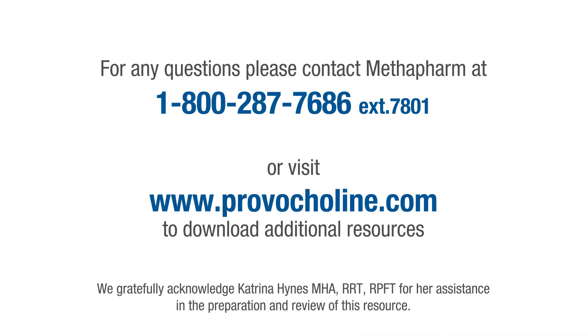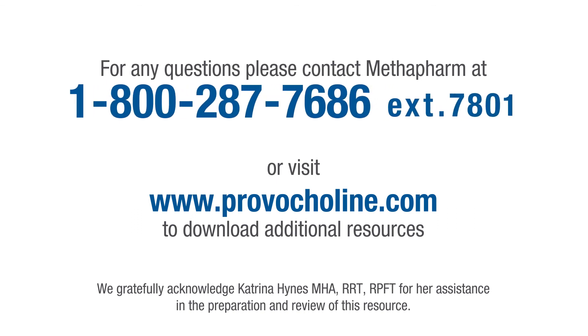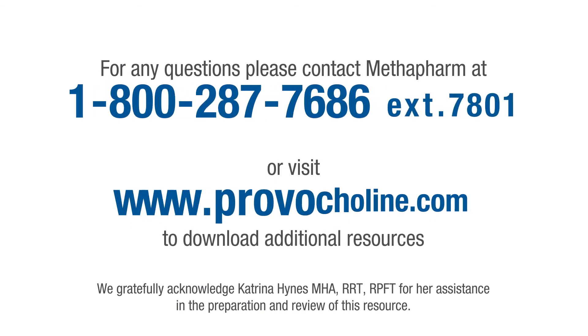We have reviewed the steps required for reconstituting Provocholine in preparation to perform a Methacholine challenge test. Careful attention to the details is critical to ensure all dilutions are correct and that the patient will be accurately dosed during the procedure. For any questions, please contact Methapharm at 1-800-287-7686 or visit Provocholine.com.